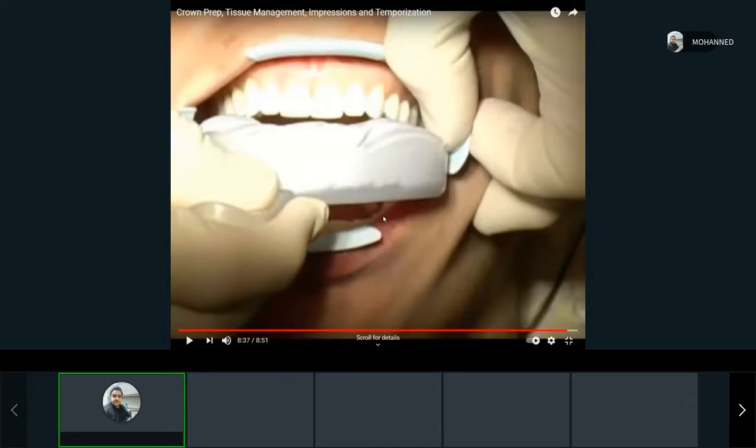And again, we wanted to be really careful. So they put the floss in and thread it through instead of pulling it out because it can pop that out, right? But you guys understood how we did this, right? We took the impression before we prepared it, and then after we prepared it, we used some material. Now, what are they taking? They're taking an opposing arch. We didn't work on that arch at all, right?